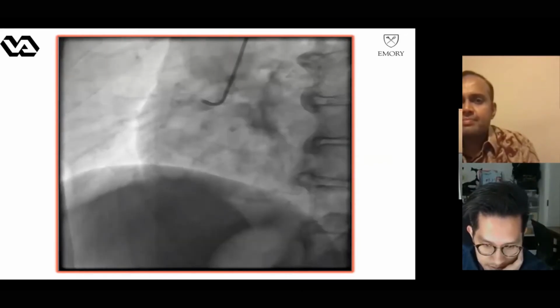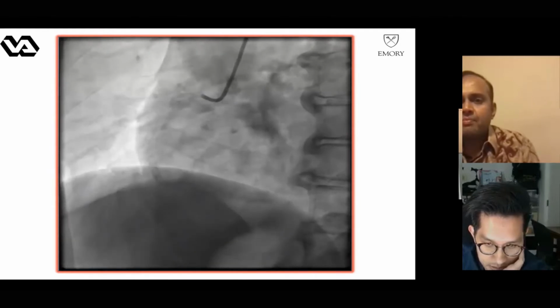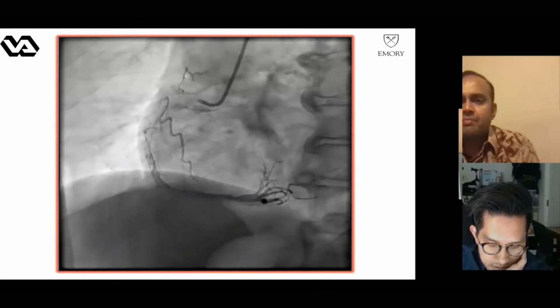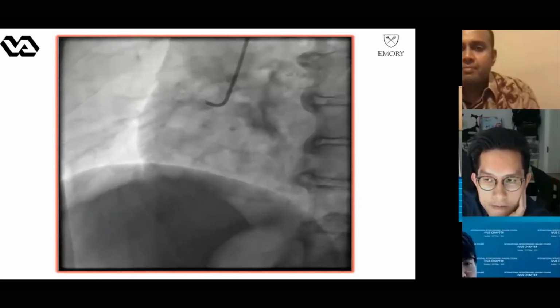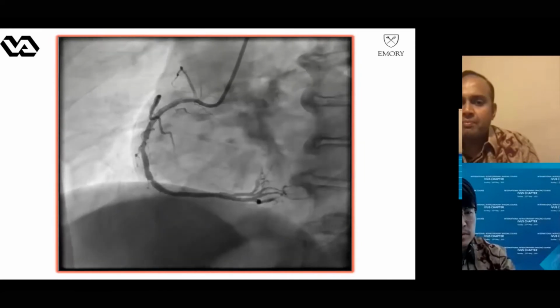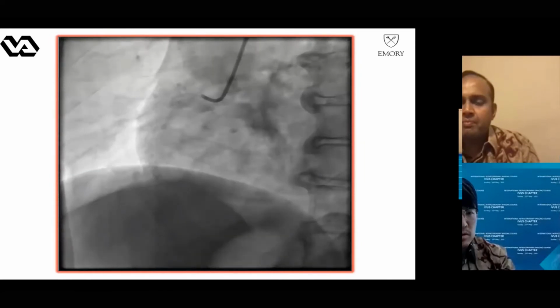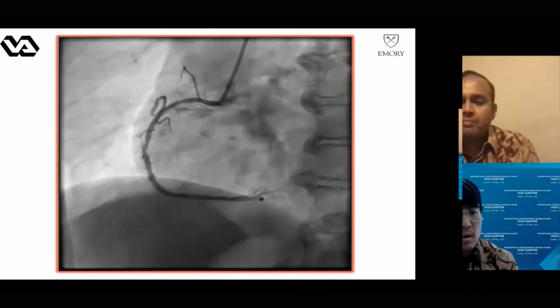Yeah, I think the stent is already placed in a very calcified lesion. So I think it's just a post-dilation, and a big-diameter NC balloon does not function at this moment. So I agree with my Hong Kong friend.